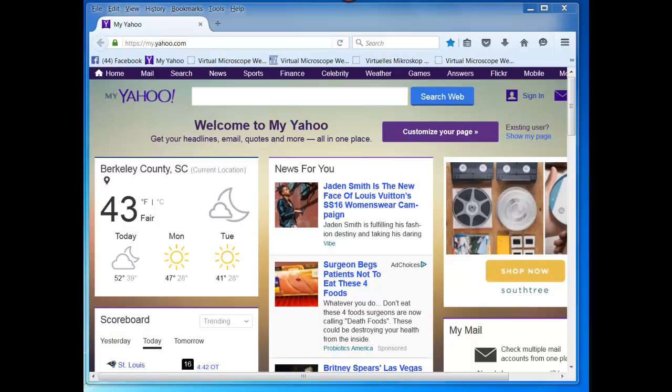The other is to be able to access specimens within a Blackboard quiz, logged into Blackboard within Biolucida, so you can interact with virtual slide specimens that we also use in quizzes and exams. So to get the installation file, you go to biolucida.net.